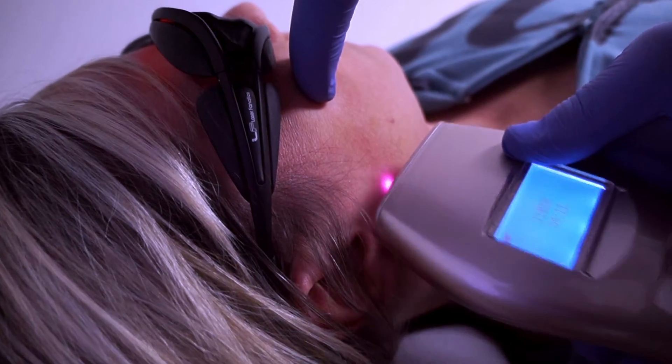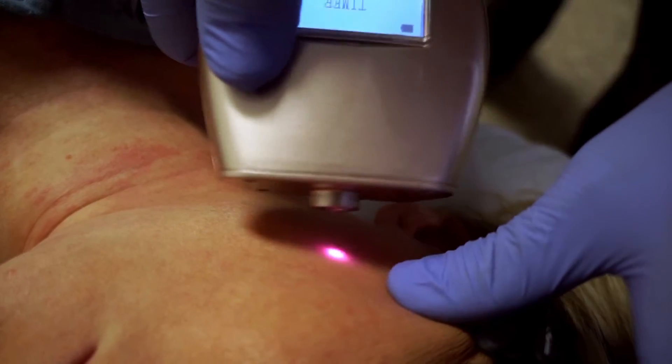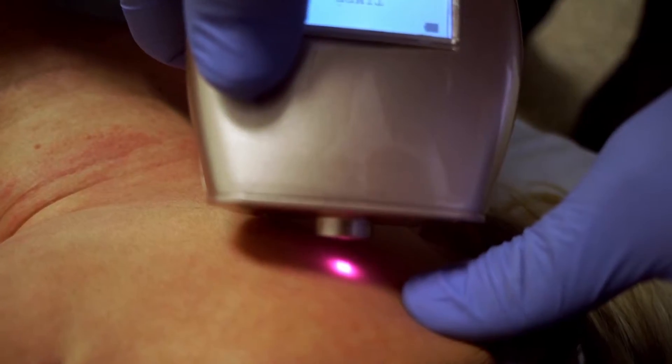As you treat the patient, ask if they are comfortable and feel the heat from the laser. Note that it is common for the patient to feel warmth.